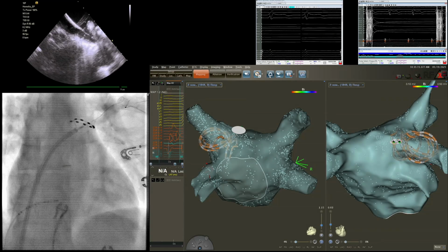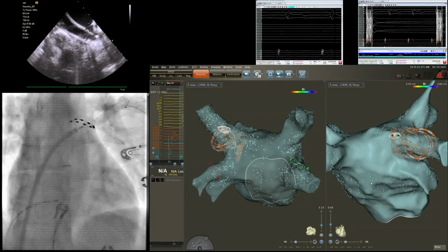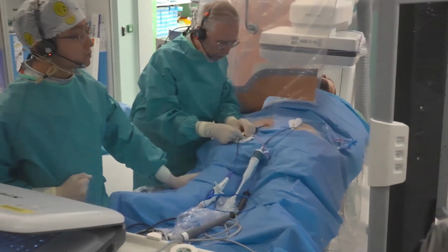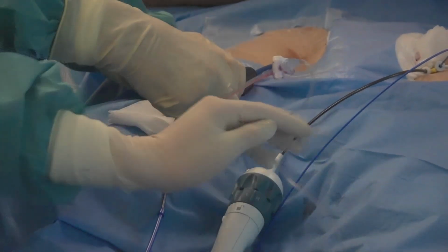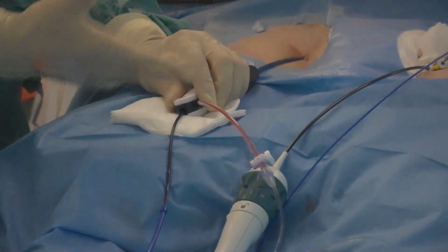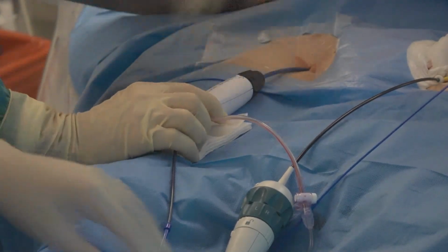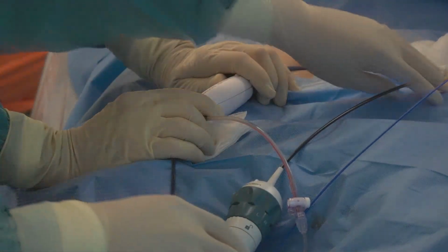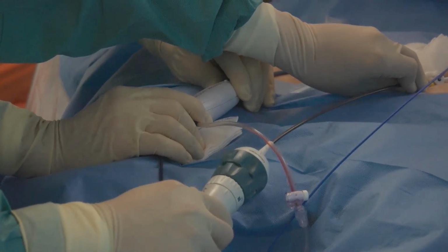And I didn't mention something about the sheeting, so we need to be careful with this sheet. As Atul explained, you can focus with the camera on the side part of the sheet. It's a little bit of a kinking effect. I think the company needs to improve the sheet because I have a third patient and the third kinking. So I'm not too happy about this. It could cause troubles with the bubbles and whatever. Does it block off, kink off? Yeah, kinking, yes.